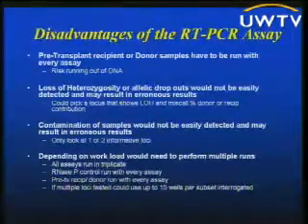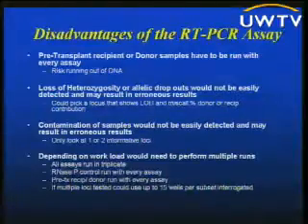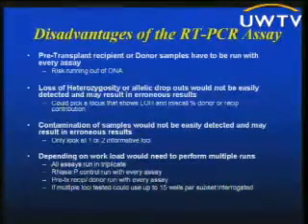And finally, the workload would need multiple runs, because all the assays are run in triplicate. You run a control with each of them, you run a calibrator with each assay, and if you're looking at multiple subsets, which is what we do in the lab for each donor-recipient pair, then you're looking at a truckload of work. So it's nowhere near as high throughput at the front end as the STR assay.